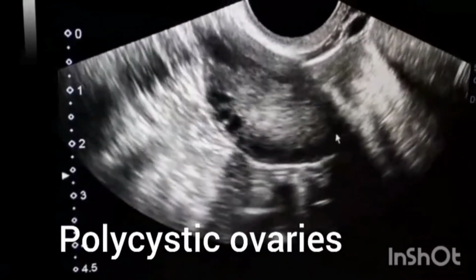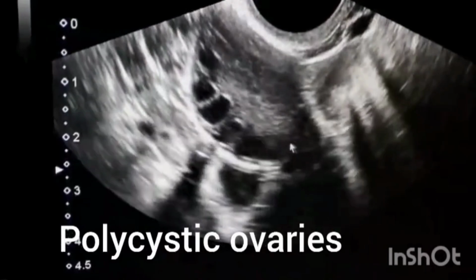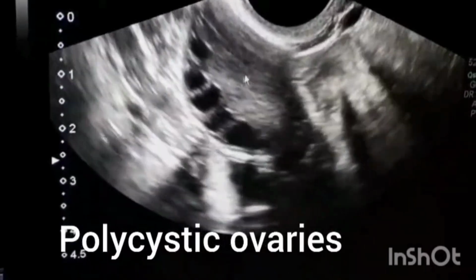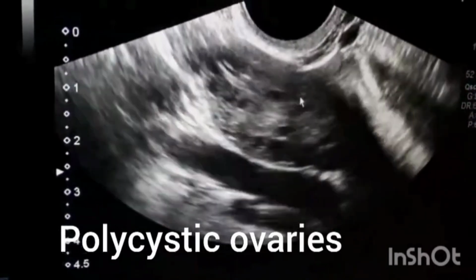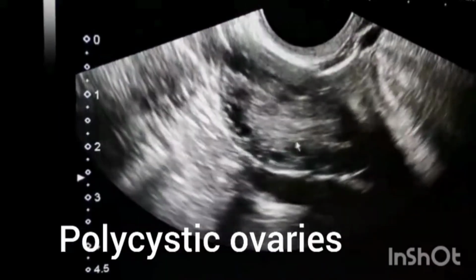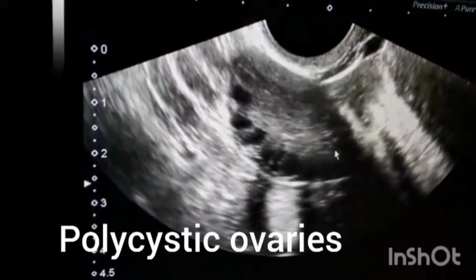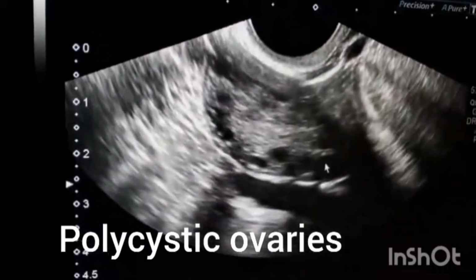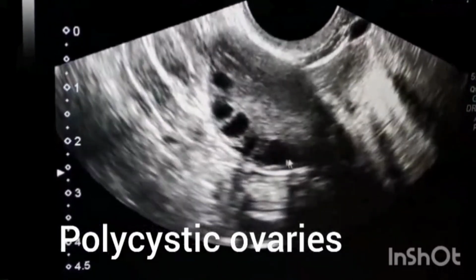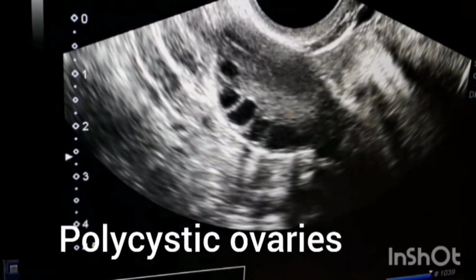Transvaginal scan; transabdominal scan can also be helpful on some occasions with good probe handling. This is ovarian stroma, and peripherally arranged are these black, hypoechoic small follicles. These are follicles peripherally arranged.